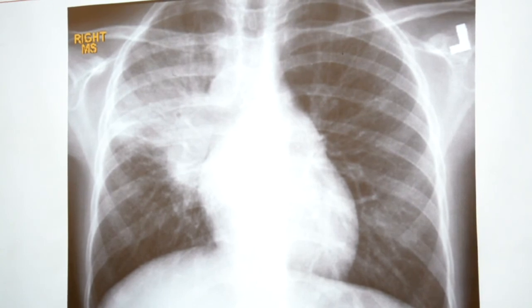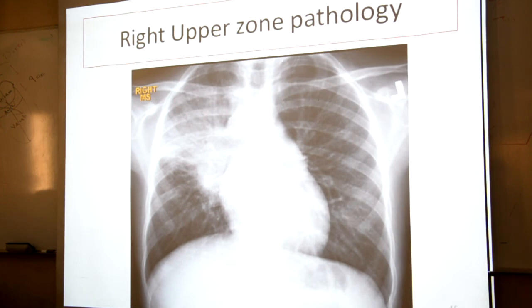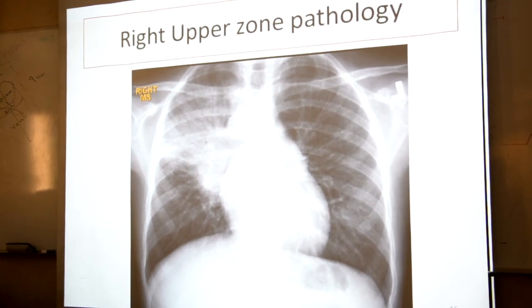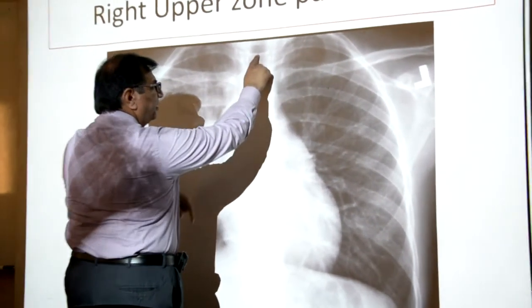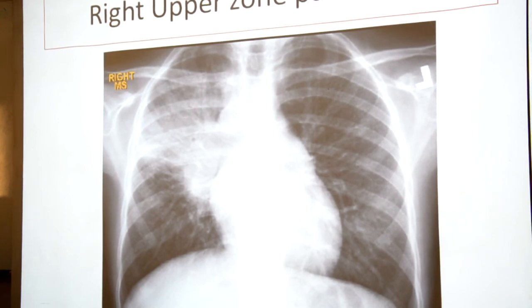Now let's see this example. If we want to assess this chest X-ray, so far we have learned, we apply here. This is a chest X-ray, PA view or AP view? PA view, with a good centering. We remember that the distance between the medial ends of the clavicles from the spinous process is normal. So with a good centering, there is no deviation, and it's a PA view, not an AP view. Then the trachea is central or deviated? Central and normal diameter.